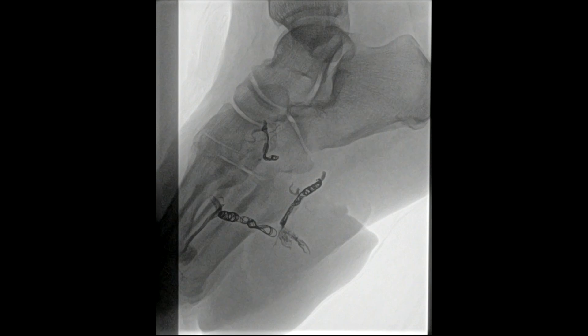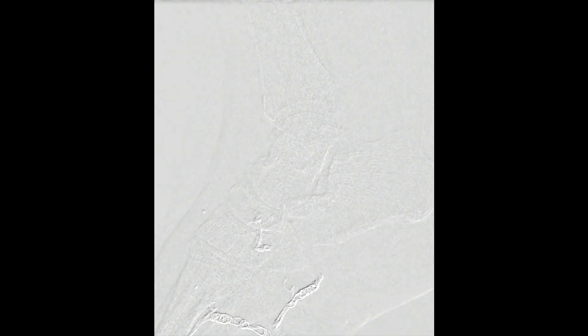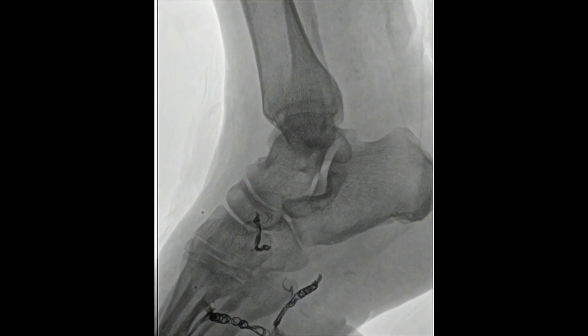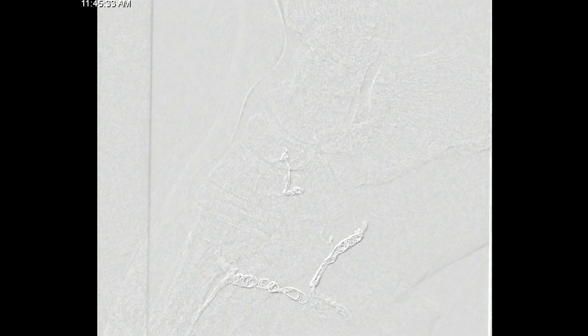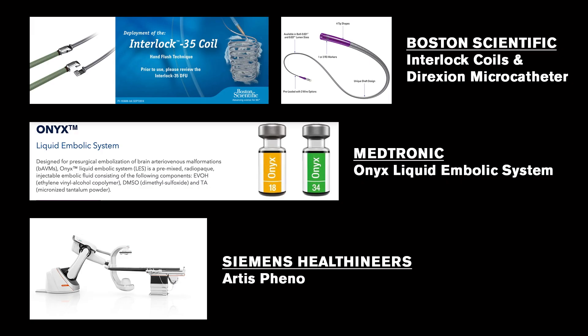We removed that microcatheter — once you inject onyx you can't inject dye through it, so you have to take it out. Injecting now at the level of the popliteal artery, you can see there's yet another branch feeding it. At that point we'd spent quite a bit of time both embolizing with coils and onyx, so we opted for one more injection of onyx to take out that other feeding branch. The microcatheter was getting close to the axial circulation, so careful injection was essential. After that onyx injection it wasn't filling nearly as well, so we opted to stop. The final injection at the popliteal level showed most of the malformation was gone. These are examples of the devices and onyx used to complete this case.